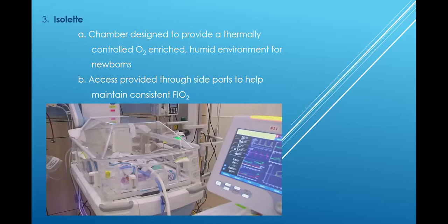Yeah, this one's an actual container. And you have little places where you can stick your hands in. It's got like a little glove in there. You stick your hand through the glove and you can manipulate the baby, touch them and do whatever you need to do. That'd be respiratory.